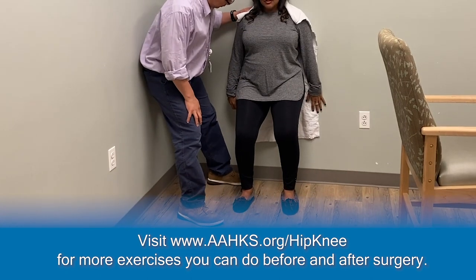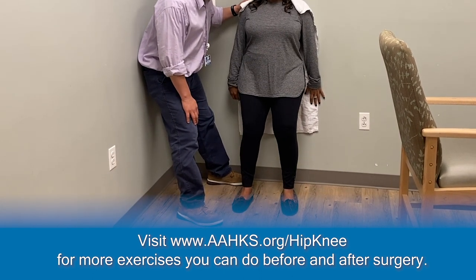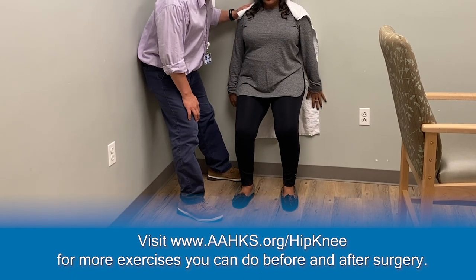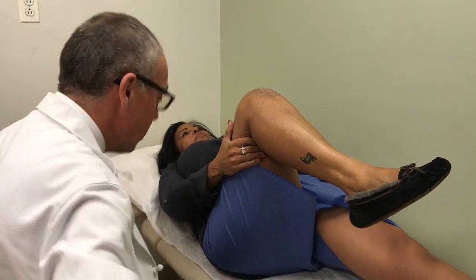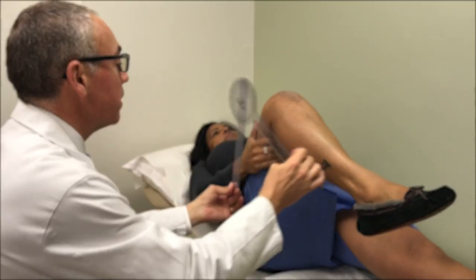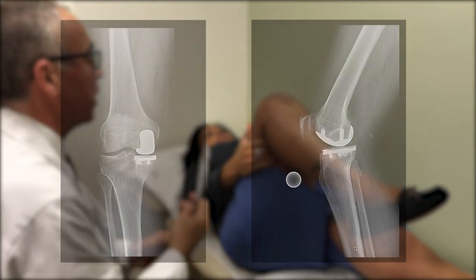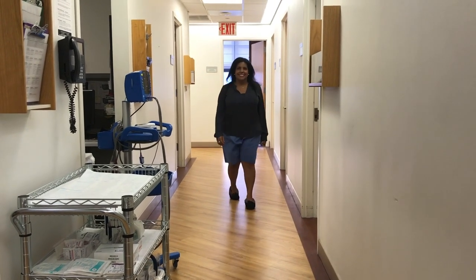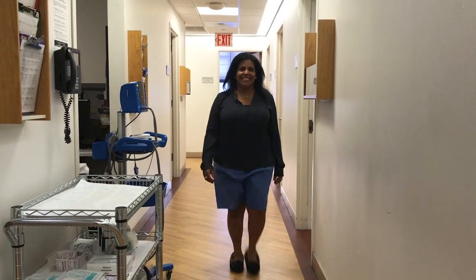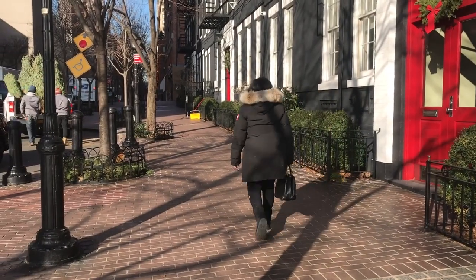You will do exercises to gradually improve your range of motion and muscle strength before and after you leave the hospital. You will need to be fully involved with the physical rehabilitation of your knee to achieve the best possible result. Working with a physical therapist several times a week for the first few weeks after surgery can help get you on track. Your surgeon will see you within a few weeks after surgery for an examination and follow-up x-rays, and new exercises and instructions will be given as you progress. You should be able to walk without a walking aid in about three to four weeks.